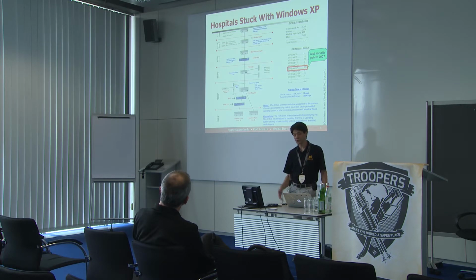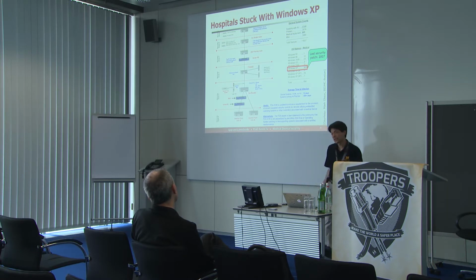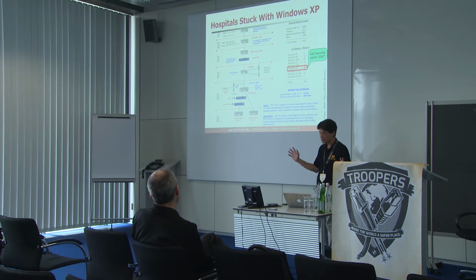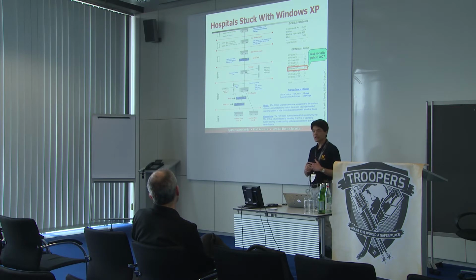Sometimes the manufacturer just doesn't provide any software updates. Other times it's operationally not possible. The mean time to infection is 12 days on these kinds of devices when they don't have a traditional IT security product like antivirus. But even when they do have something like antivirus, which has its own risks, it typically doesn't last more than a year before getting infected. So you can imagine the workload put upon the IT security specialist inside a hospital.